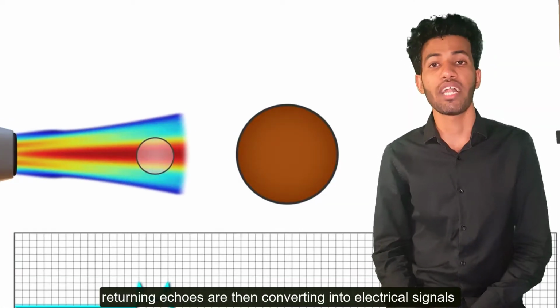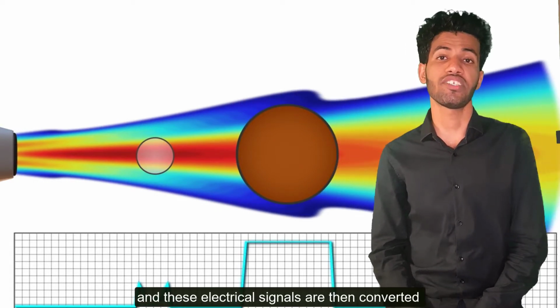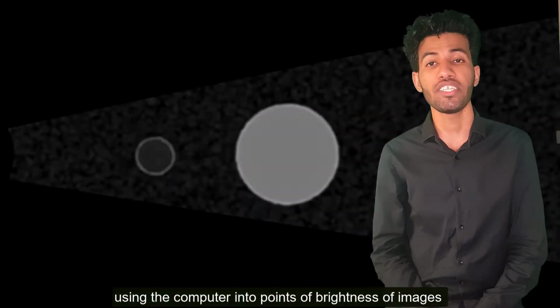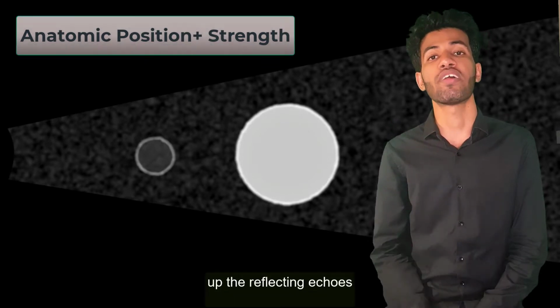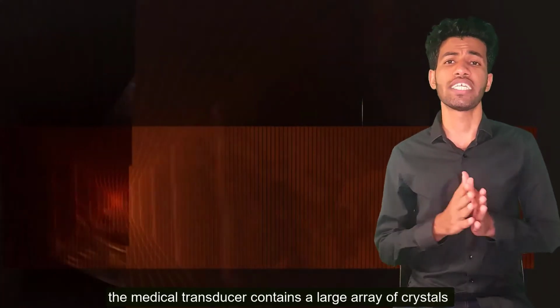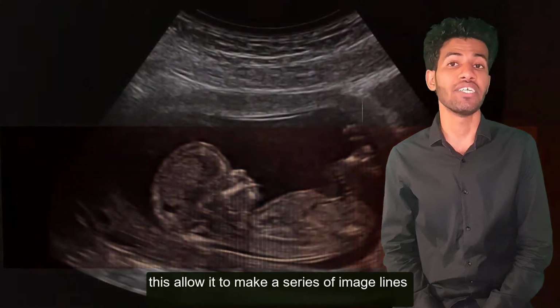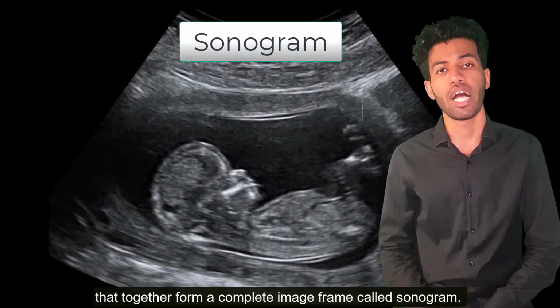Returning echoes are then converted into electrical signals, and these electrical signals are converted by the computer into points of brightness in the image, corresponding to the anatomic position and the strength of the reflecting echoes. The medical transducer contains a large array of crystals. This allows it to make a series of image lines that together form a complete image frame called a sonogram.